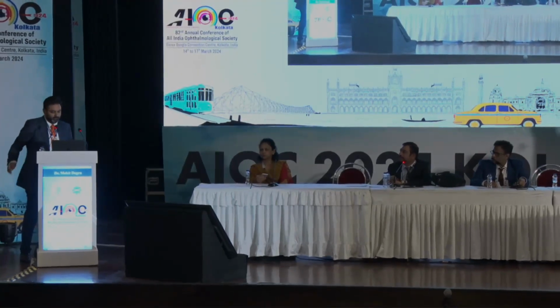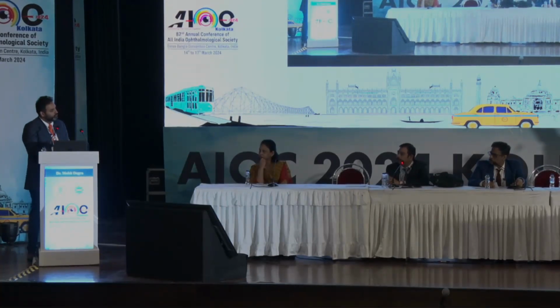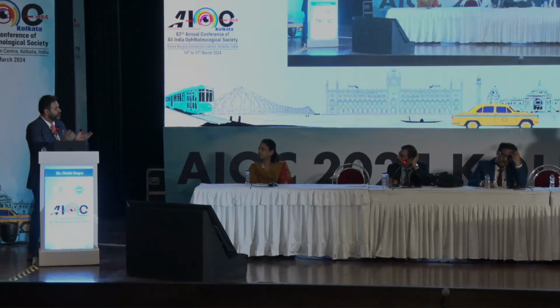Yeah, so three or four things, sir. I think that's a great question and multifaceted, but if I were to answer that quickly, the technology is not that widespread. There are a lot more people doing retina and ophthalmology than there are these fundus cameras out there. They're expensive, not easy to come by, and not everybody has access to them. That is one. Documentation is the need of the hour, not just for yourself, for research, but also for medicolegal purposes. You fix a retina, and for the most part, most people do not do pre-operative retinal detachment imaging.